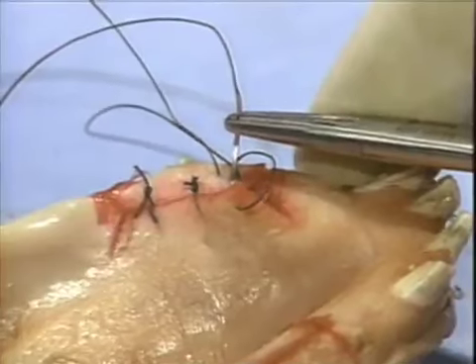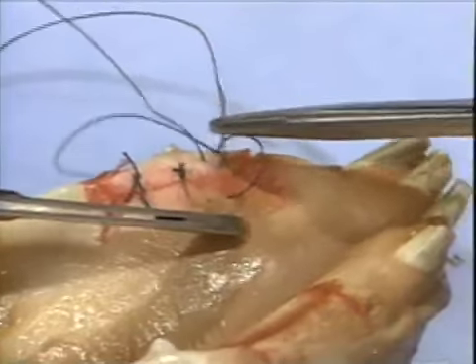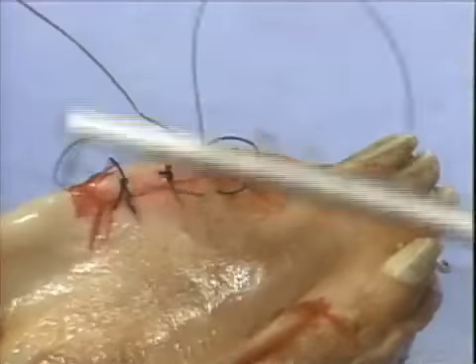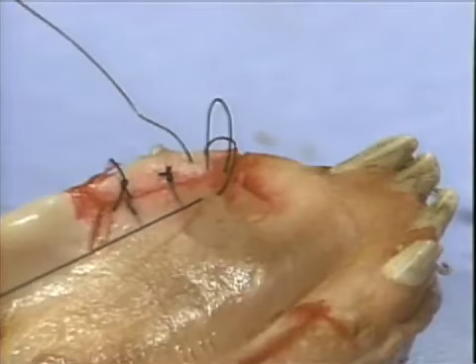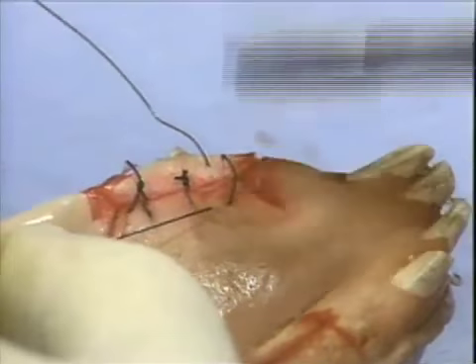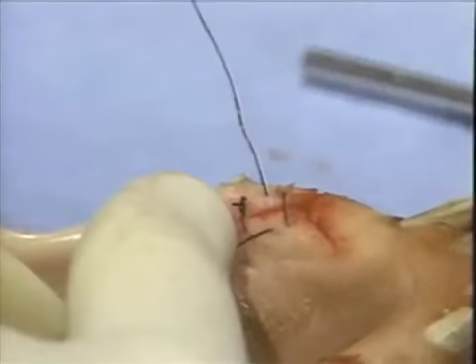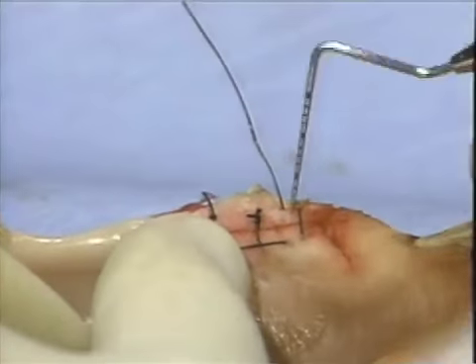Again, the suture material lies exclusively internal to either the buccal or lingual flap and will not cross the incision to this point. However, as the suturing is completed, the suture material will lie external to both the flap and incision. Primary adaptation of the buccal to lingual flap is nicely accomplished with the suture material lying external to the incision.